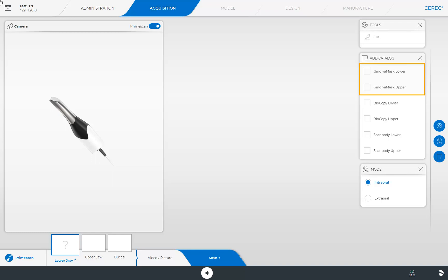remove it after 10 to 15 minutes, and scan only the area of the implant position and the adjacent teeth. The corresponding gingiva mask image catalog can then be displayed during the editing of the design so that the emergence profile can be outlined optimally.